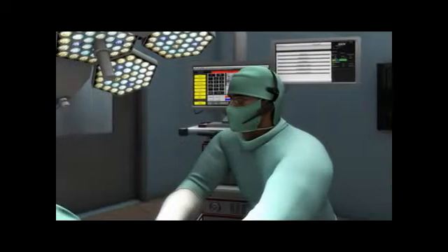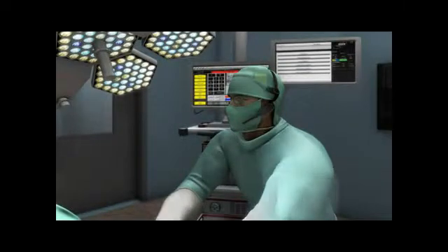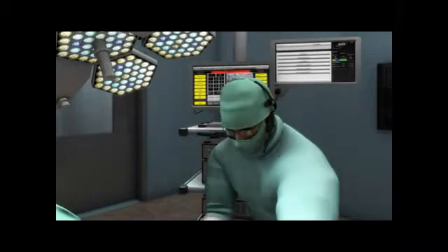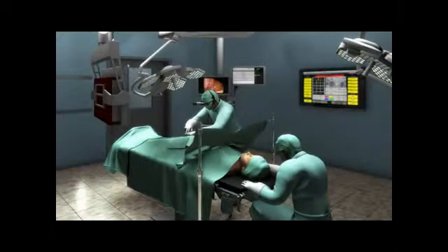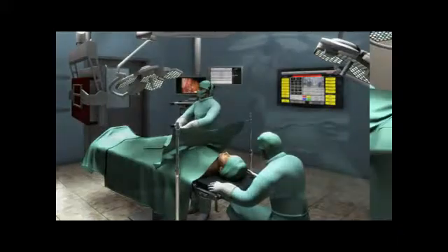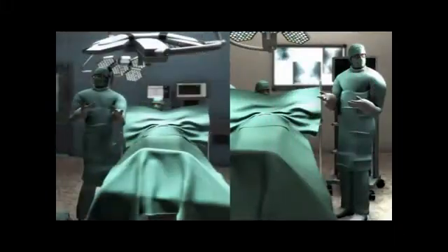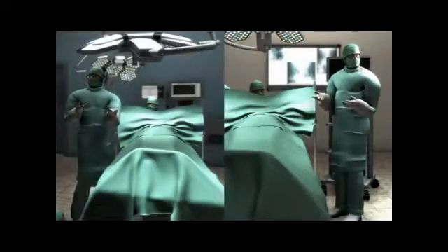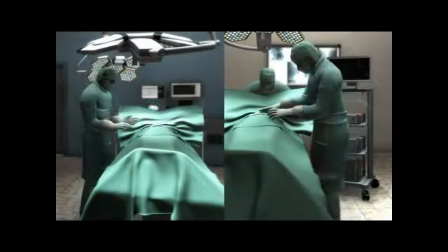The surgeon in the Core operating theatre has now put the headset on and is using the Core voice control system. The surgeon can now control all the functions integrated in the Core system. Everything is ready now. The operation is beginning.